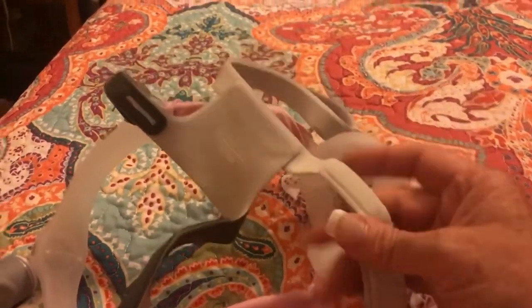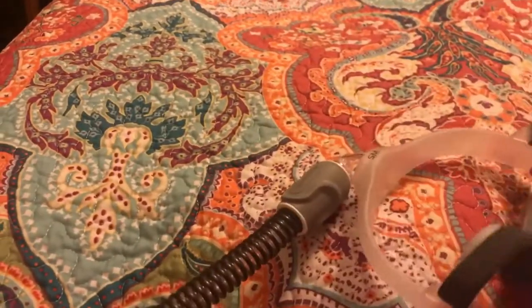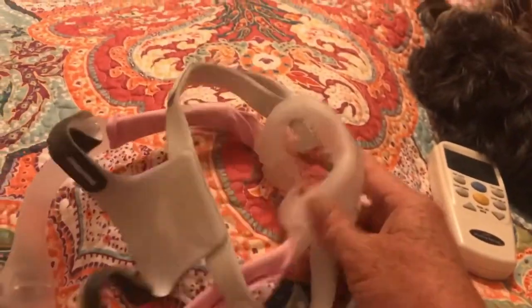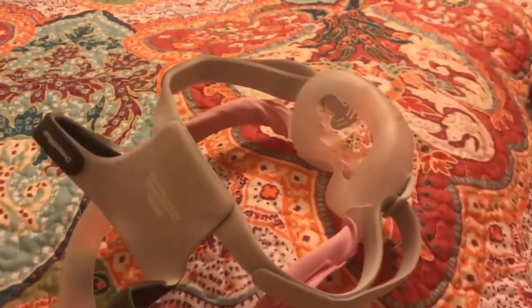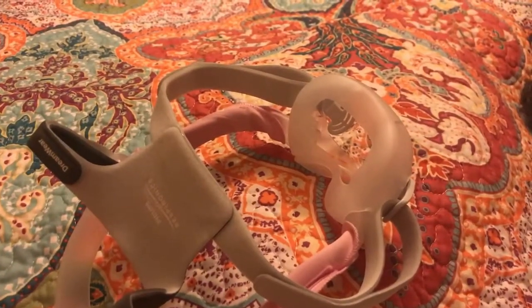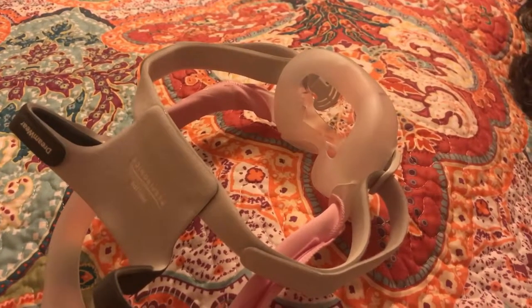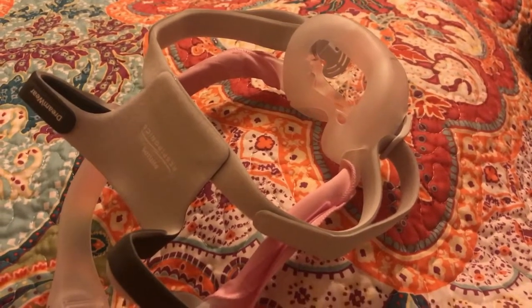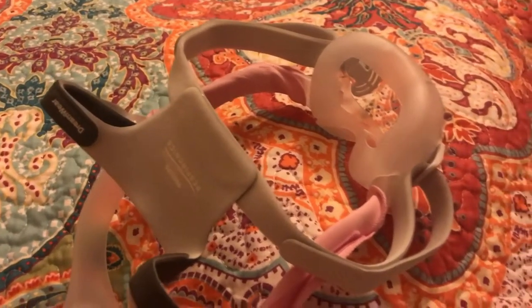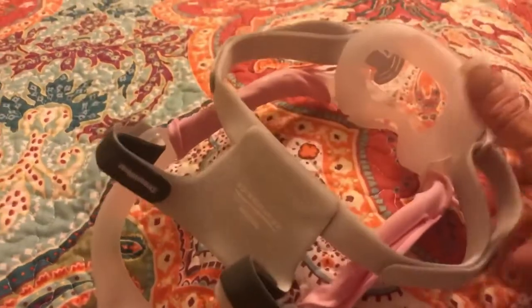She did put it on me at the place where I picked it up, and I had it on for probably a couple of minutes. She turned some pressure on and I really couldn't even feel the air pressure until I went to pull it off — that's when I realized, wait, there's air coming out of there. It's really quiet, so hopefully Mikey won't feel like he's sleeping with Darth Vader anymore.